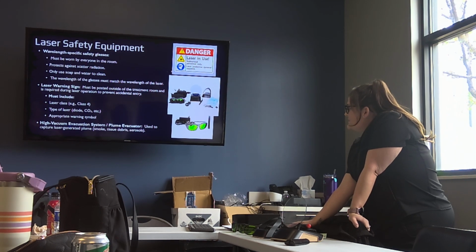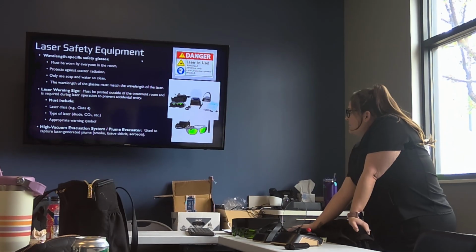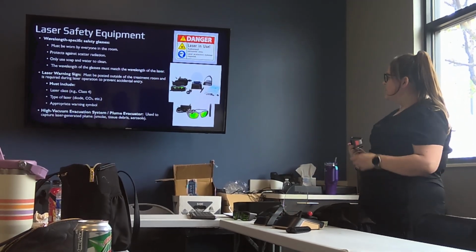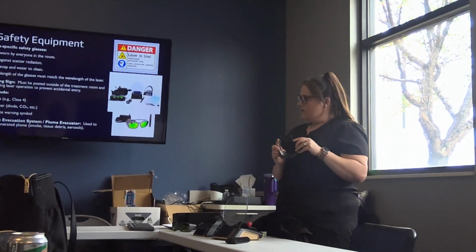So that laser safety sign that I was just talking about, that's what that looks like. But when it comes to the safety glasses, each type of laser has different glasses that go with each one.